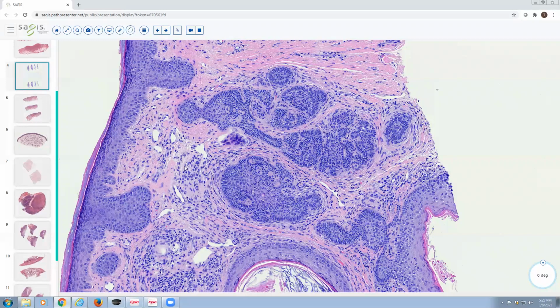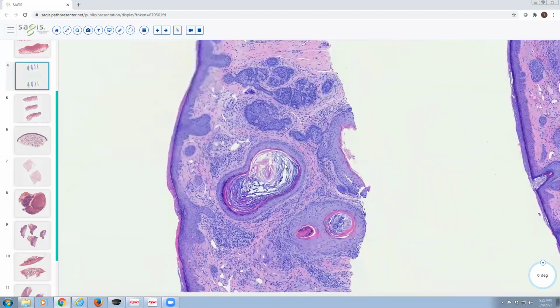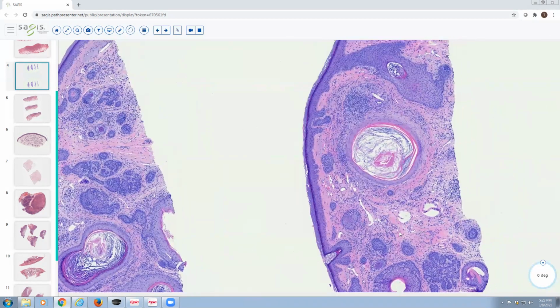Look at the stroma. It's going to be more cellular and dense in a trichoep. You have retraction from stroma to stroma in a trichoepithelioma, just like you do in a trichoblastoma. But there's no retraction between tumor and stroma in a trichoep. Just like a trichoblastoma will have papillary mesenchymal bodies, you can expect to find those in a trichoepithelioma as well.